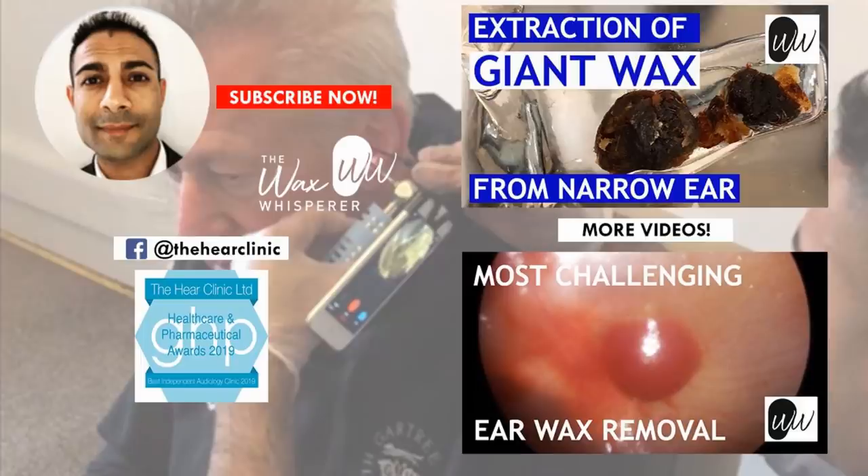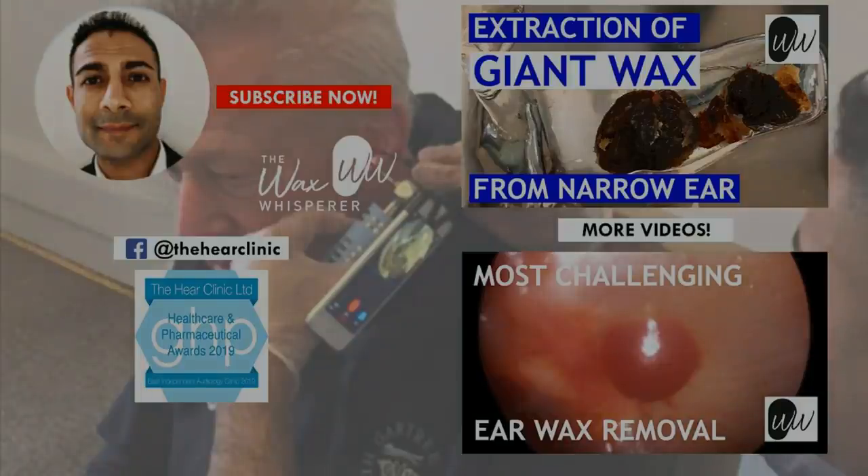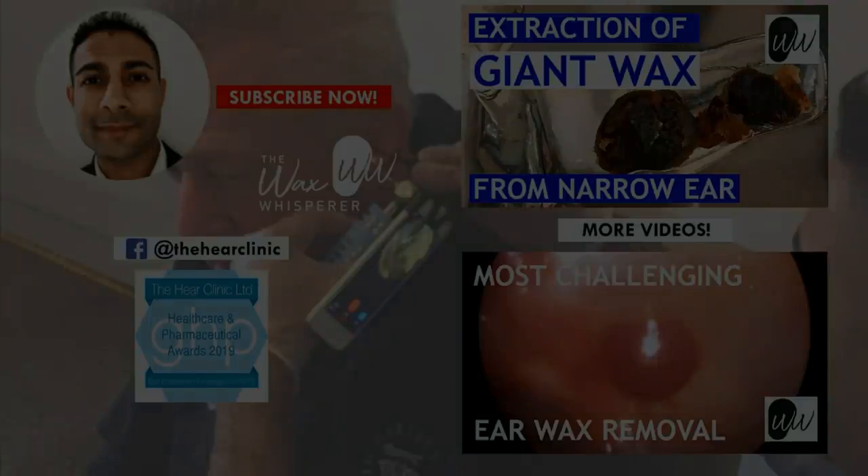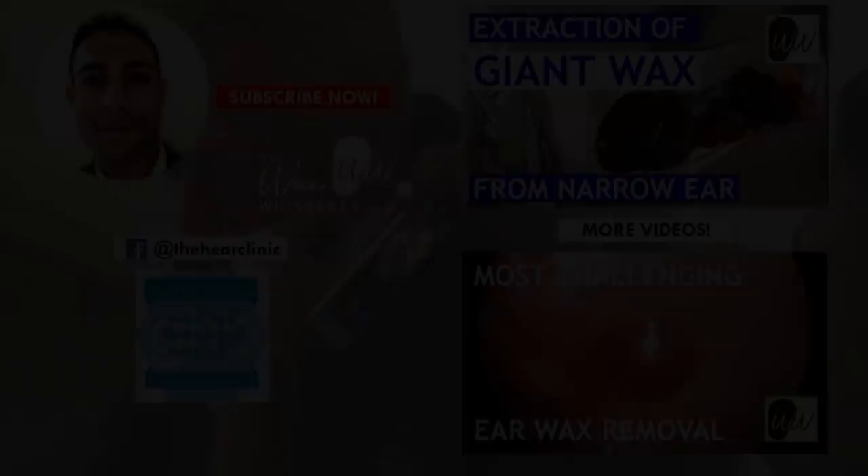I always compare that to a Sunday roast — you've got your gravy and you finish your Sunday roast, and then before you wash the plate, you get your knife and fork and swipe across the plate to get rid of all the larger chunks of food. It just leaves you with the staining of gravy. That's what's left behind on the eardrum — you don't want to try and remove all that because you can end up perforating it. I hope you enjoyed that video. I love those procedures when you've got medial earwax — the endoscopic view is just amazing. Even now, sometimes I'm blown away by the view the endoscope provides. Take care guys, and I'll upload more videos in due course. Bye.